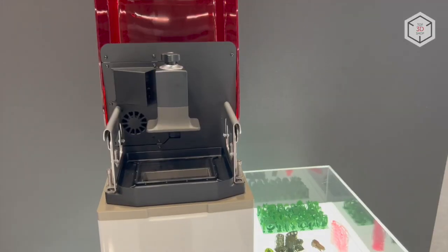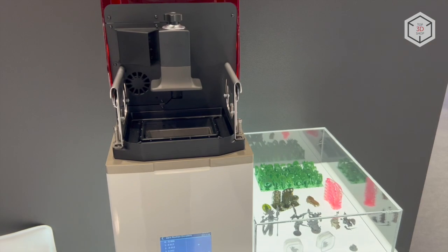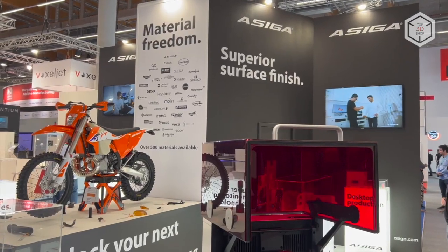Hi everyone, this is Top3DShop and in this video we will tell you about 3D printers from the Australian company Asiga.